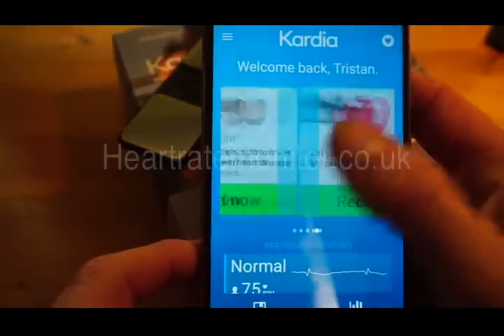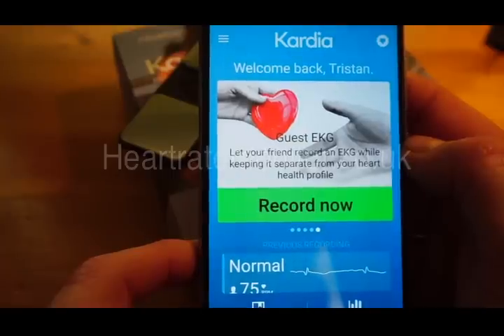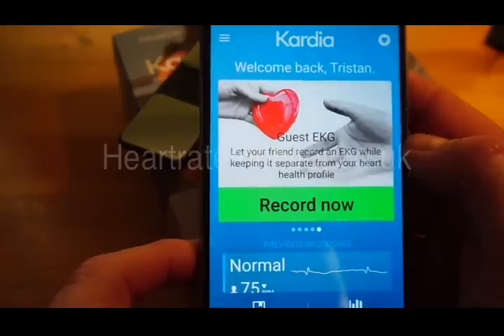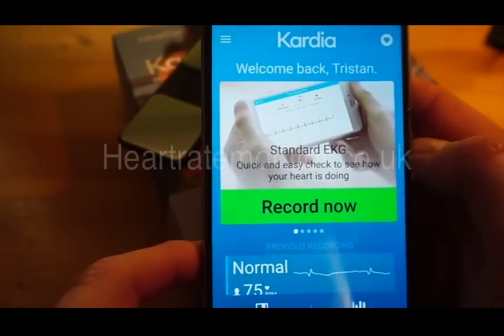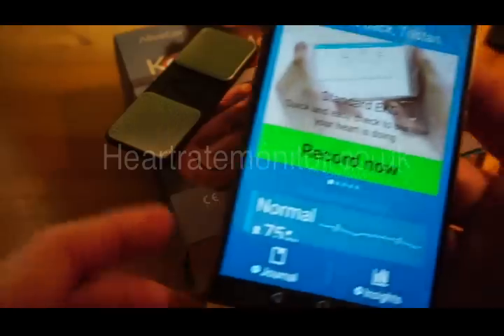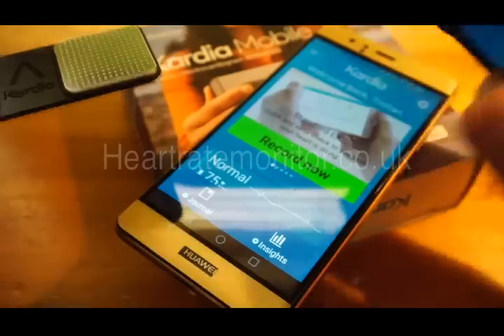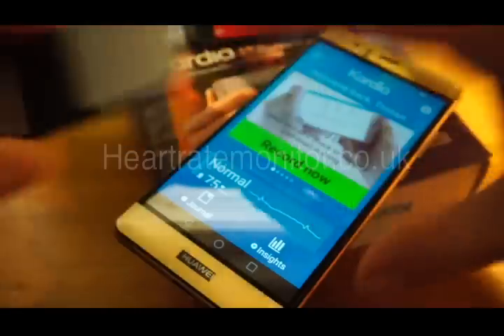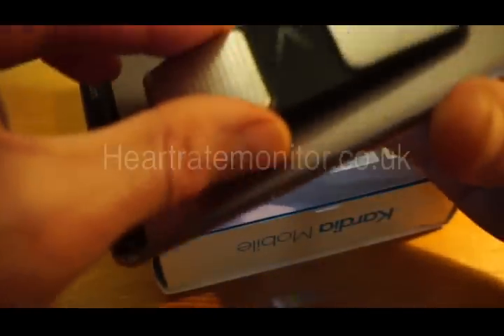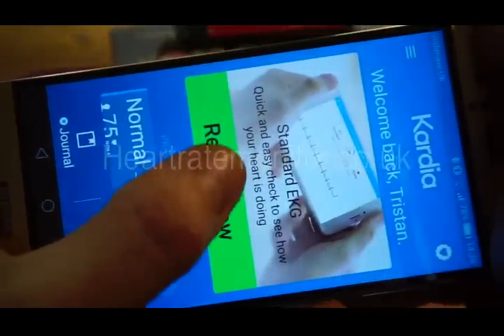You can also take a recording of your weight, and if you want a friend to take their ECG reading without mixing it into your recordings, you can do a guest EKG. To take the recording is really simple — the device comes with a little holder that has 3M tape on the back so you can attach it to the back of your smartphone, as the easiest way to record is with the device on the back of your phone. I'm just going to hold it loosely and press record.